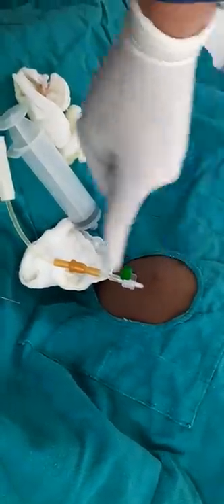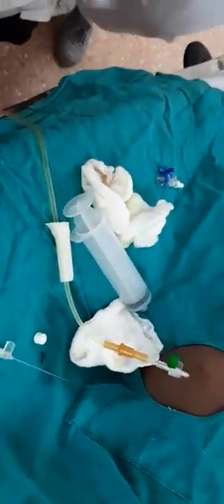Let me recap the steps. First step: wear gloves. Second step: clean the area with povidone-iodine, then clean with gauze. Third step: clean with chlorhexidine and drape. This is the most dependent part where dullness was percussed, so we go through that technique, and the fluid starts coming out. We send it for ascitic fluid culture, gram stain, AFB culture, AFB staining for tuberculosis etiology, and malignant cells.